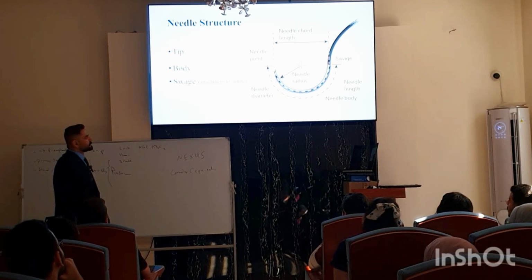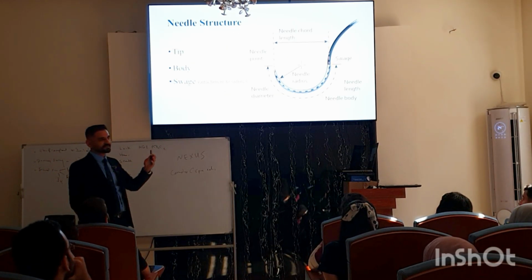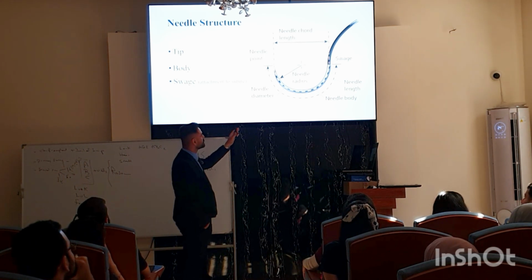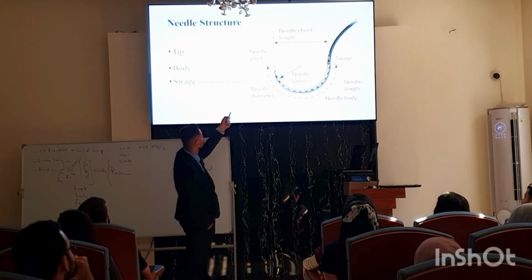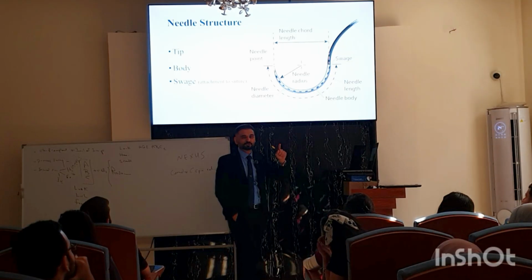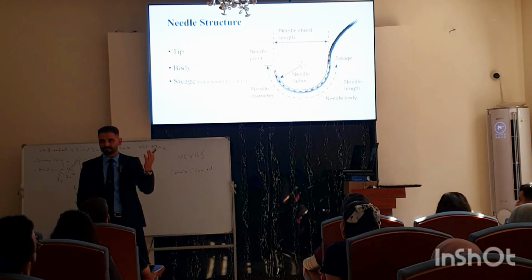Yes. This is the science of the needle. The needle itself is a science. You need to understand why every specific thing in this needle is designed like this. We have the needle points, or the head, the tip of the needle. We have the diameter of the needle. We have the radius of the circle of the needle, because most of our needles are curved, and we also have straight needles, but they're more rare.